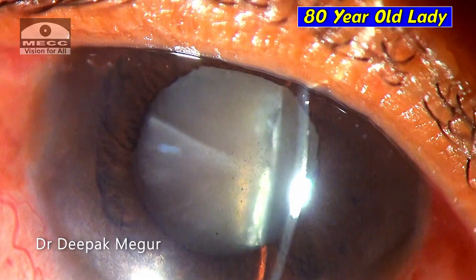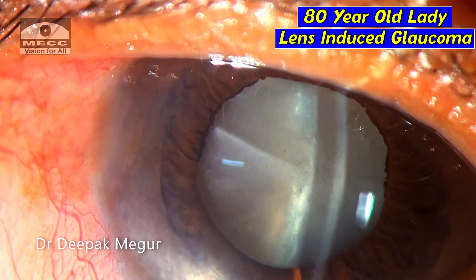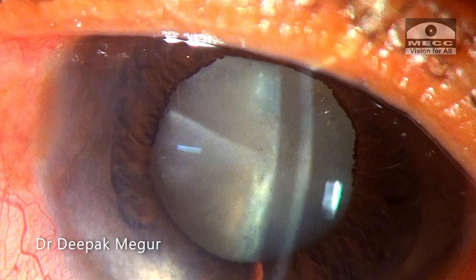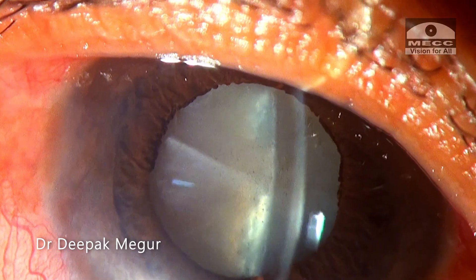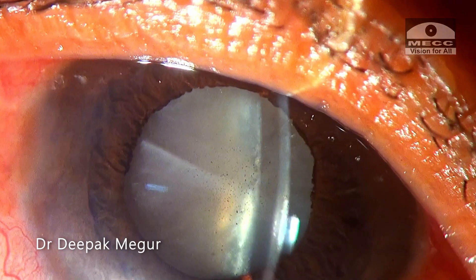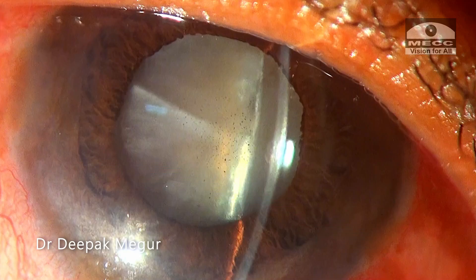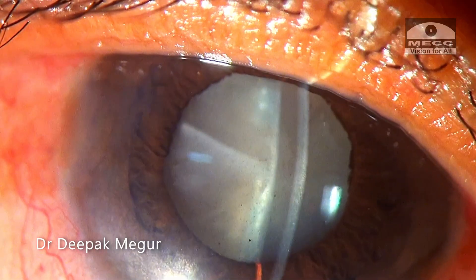This is an 80-year-old lady presenting with lens-induced glaucoma, the phacomorphic variant. She was highly symptomatic with severe pain when she presented to hospital. After treating her with anti-glaucoma medications and steroids, she was taken up for surgery. On the day of surgery, she received IV mannitol. Her pressure was 18 before shifting to the OR.